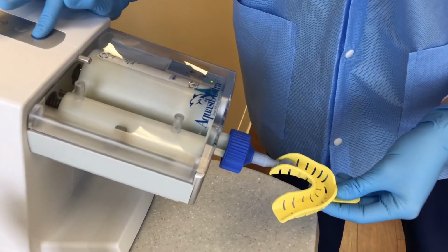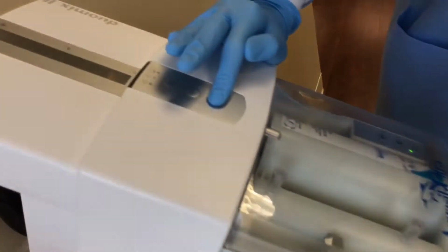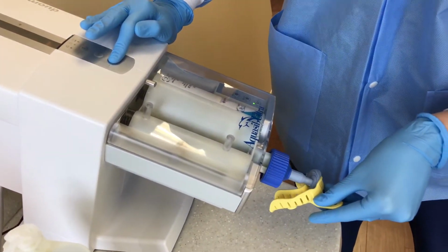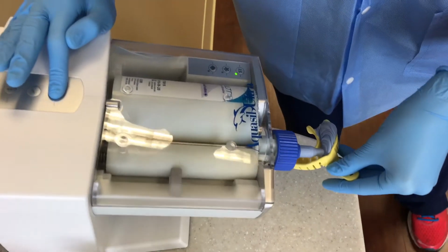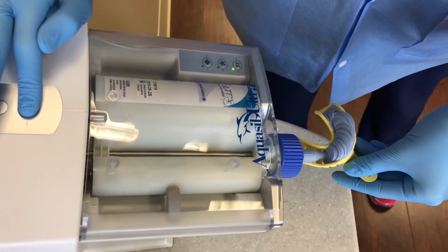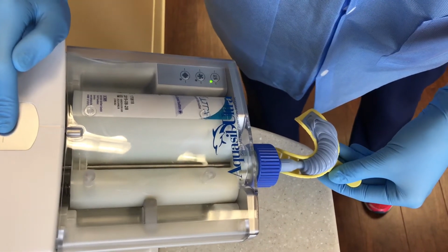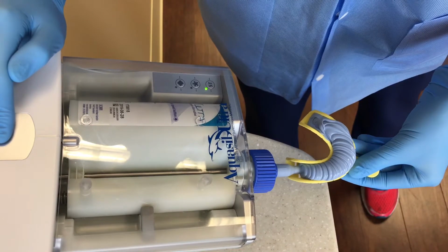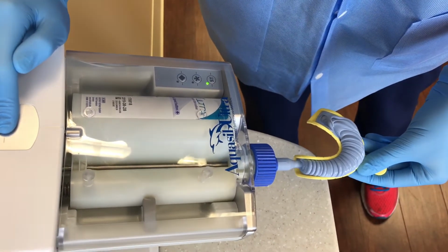And as you can see, this auto mixer fills just like you would with any tray of its sort. You just keep holding the button down, keep the tip submerged as you would with PVS material to avoid bubbles. And we probably have a little more material here than Pete really needs, but thankfully he doesn't have a strong gag reflex.